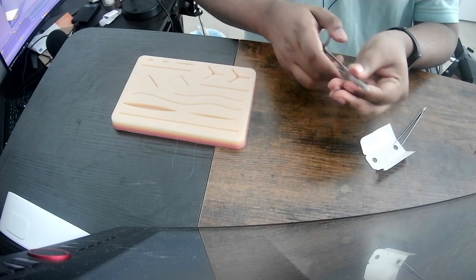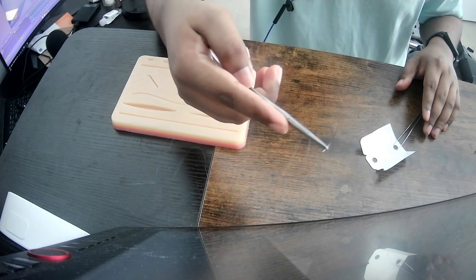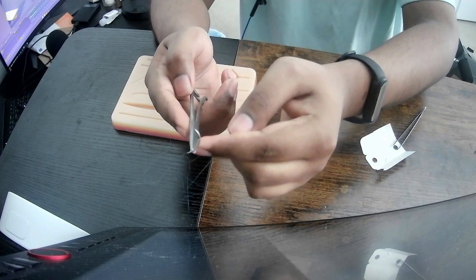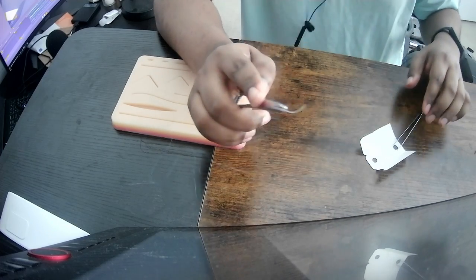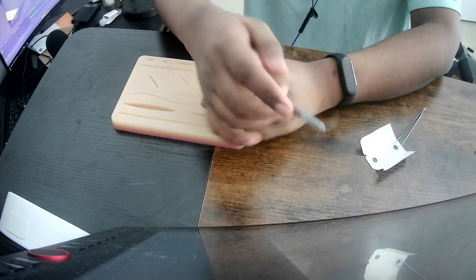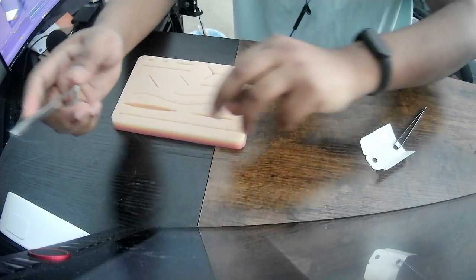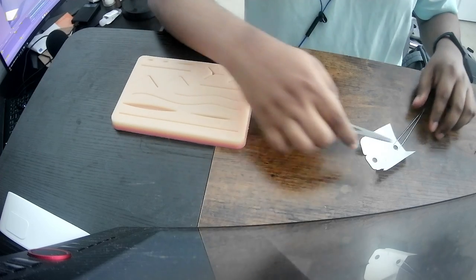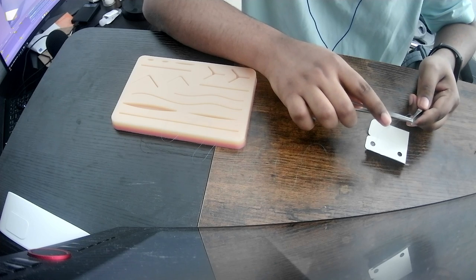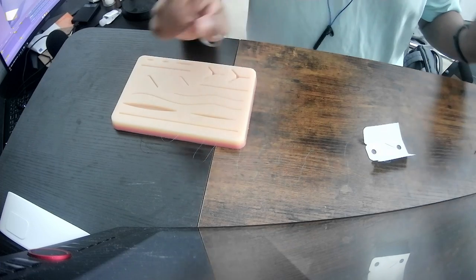Yeah, like biting it just at the edge rather than more inside of the needle driver. That provides less interference once you're driving it into delicate tissue, when you don't have much skin to bite into. But yeah, okay. Let's put it back. Let's unload it safely. Very nice. Okay.